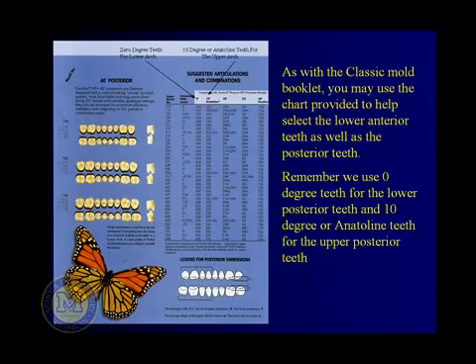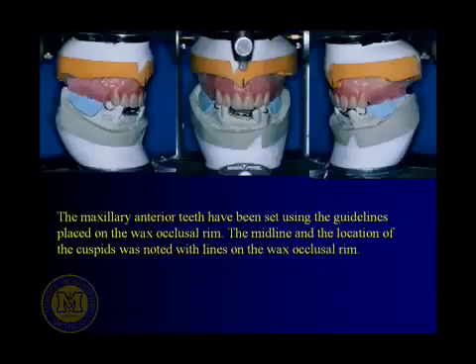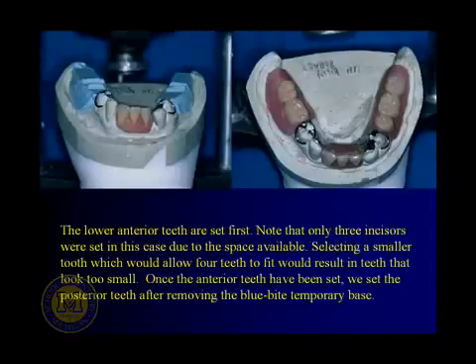We're going to do the same thing like any denture. We're going to set the teeth and go ahead and set the teeth on the partial. As happens many times with some of these, depending on how much space is left available, there was some drifting anteriorly of the cuspid on this side. So for a normal size looking tooth, you may notice we've only got 3 incisors in that lower anterior region. So what you want to do with partial dentures is look at where the natural teeth are, look at how much space you have left in which to set your replacement teeth.